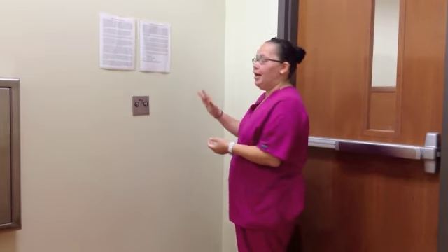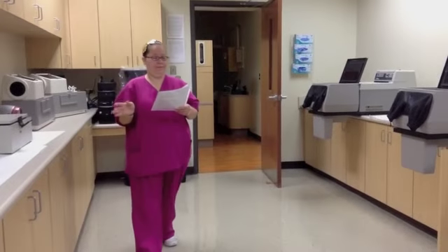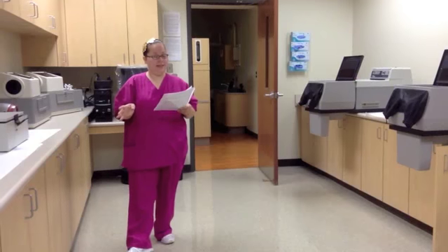After cleaning the dental treatment rooms, we're going to come and turn off the master switches. After turning off the master switches, we're going to come into the processing lab and we're going to mount, file, and process any x-rays that need to be done.